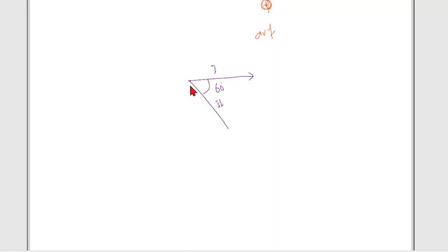Now the angle between the others is also 60, so in total it is about 120 between lead 1, lead 2 and lead 3. These are all the things I have shown to you: lead 1, lead 2 and lead 3. This is so simple and I have drawn it for you.